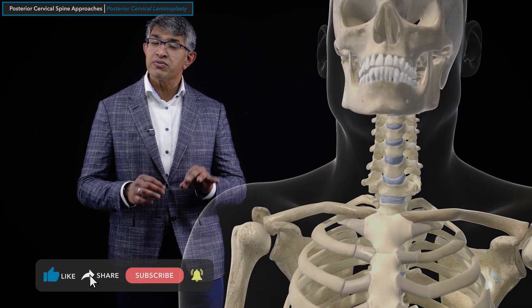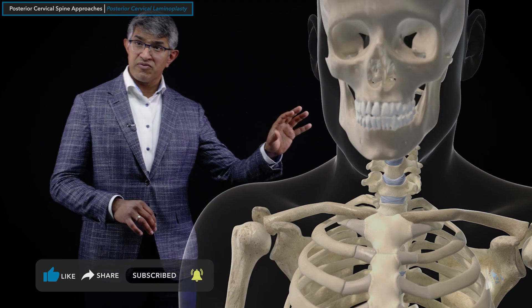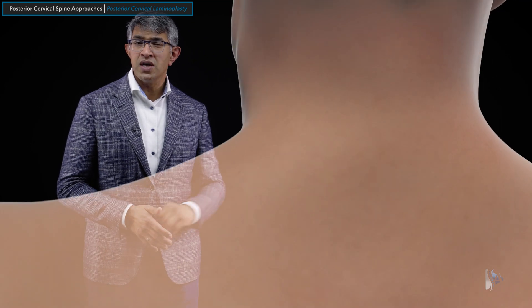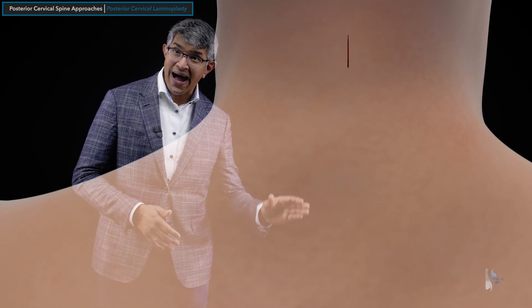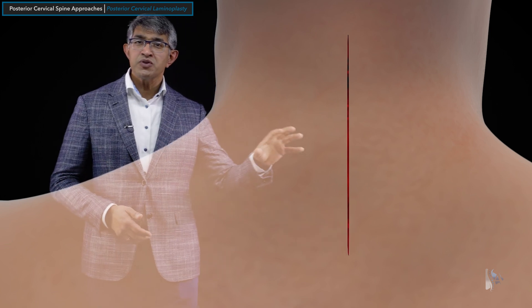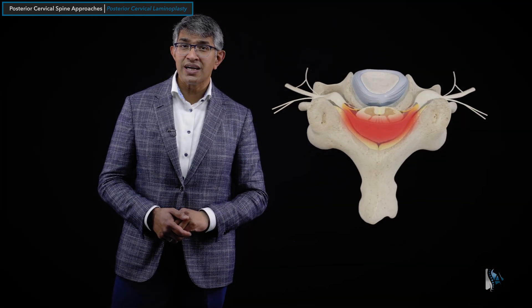This is a procedure that is done from a posterior approach. This is a neck looking at it from the front — you can see normal range of motion in this model. This is a procedure done from the back, so the incision is usually in the midline up and down. This will give us exposure to the back of the spine, and you can see here the lamina demarcated by those red lines.